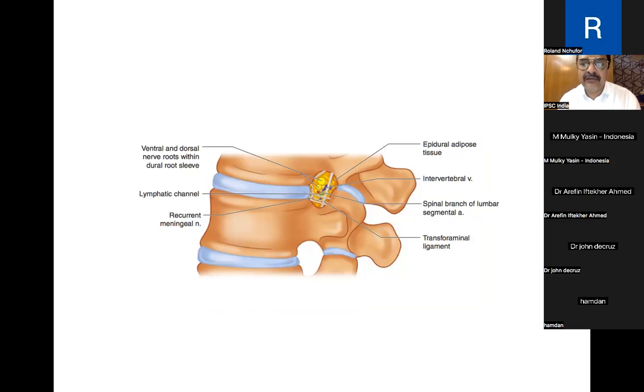Along with that, if we have an X-ray, that is also good because although we are going to do this under fluoroscopy guidance, the initial steps are under fluoroscopy guidance. But just to avoid any surprises in the operation theater, if you have an X-ray with you, that is also a good advantage to you.